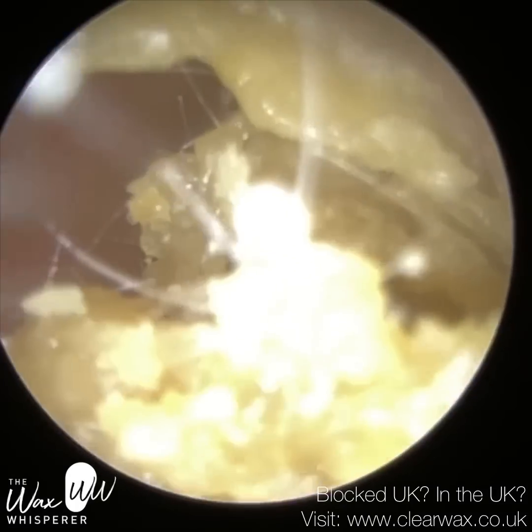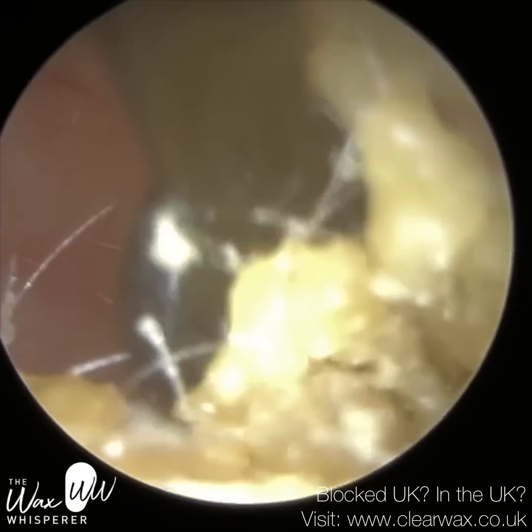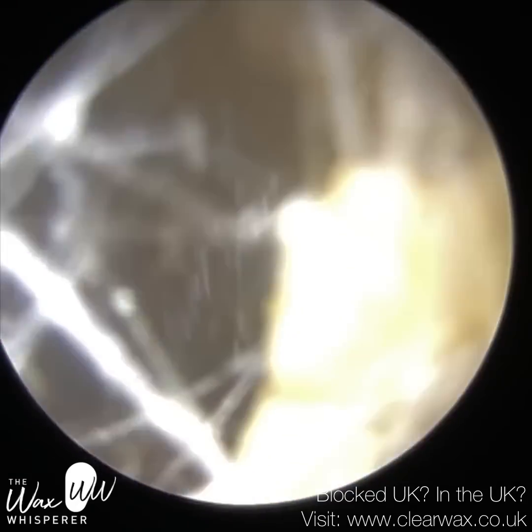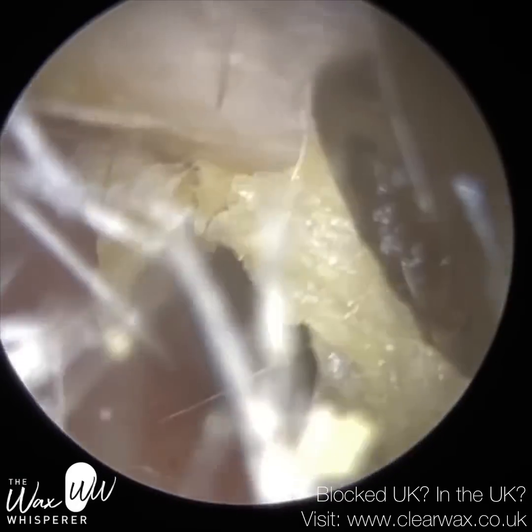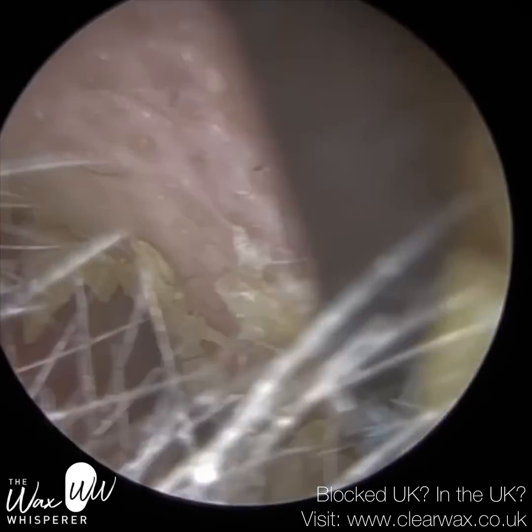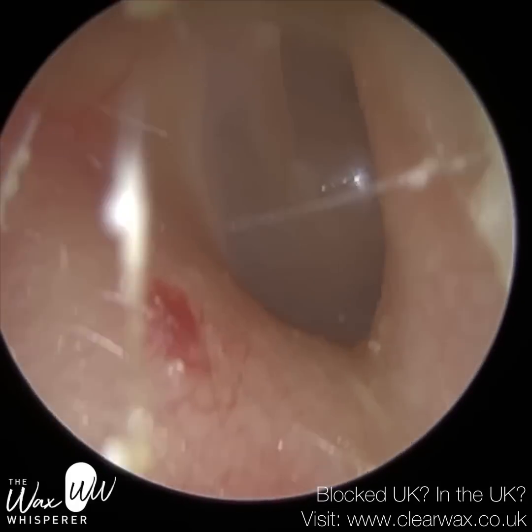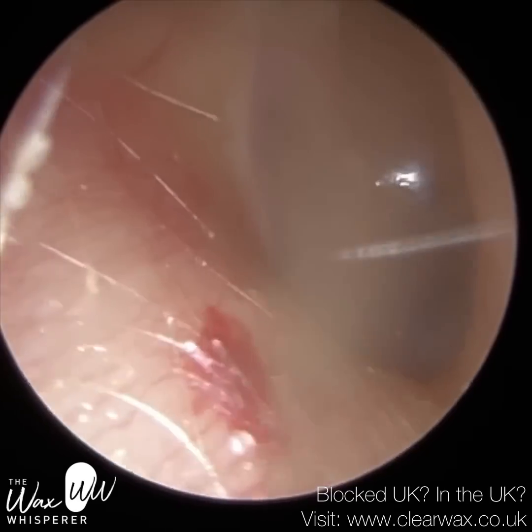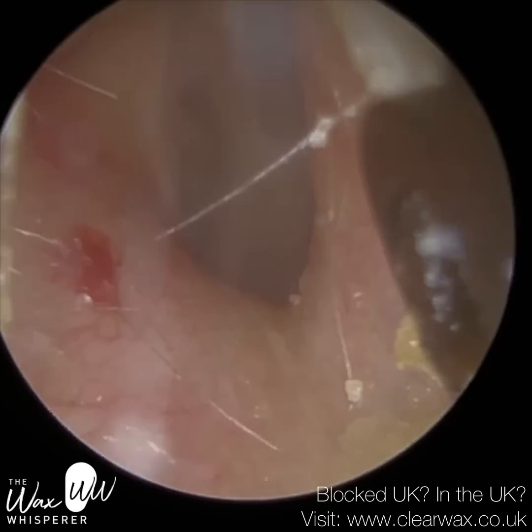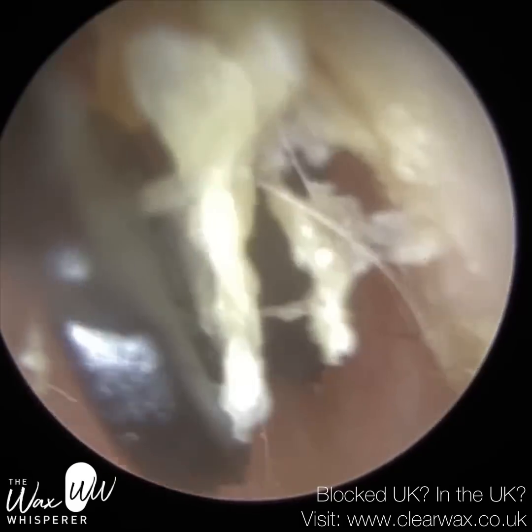So this is the patient's right ear, and you know it's keratin, dead skin, because it's very reflective. Skin contains keratin. It's a protein also found in our fingernails and hair, and keratin reflects harmful UV rays from the sun, so it's got a reflective property, and when you're shining a light against keratin and dead skin, it's quite reflective, as you can see. And this skin, it's going through the oxidization process, so fresh dead skin that's just shed is more whitish in color, and as it matures and ages and oxidizes, it turns yellow, and dead skin eventually can become brown and almost black in appearance.